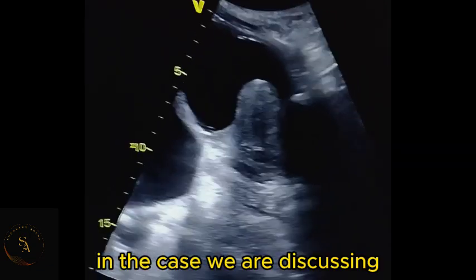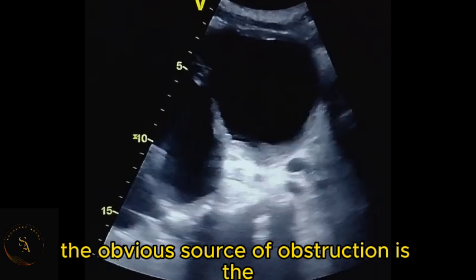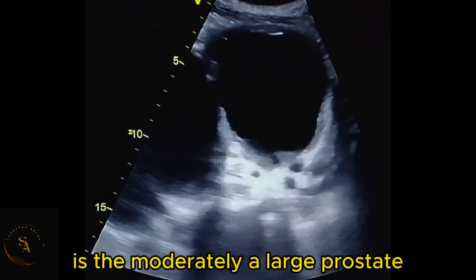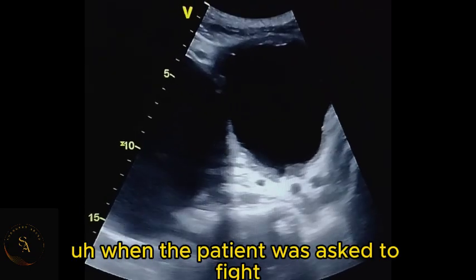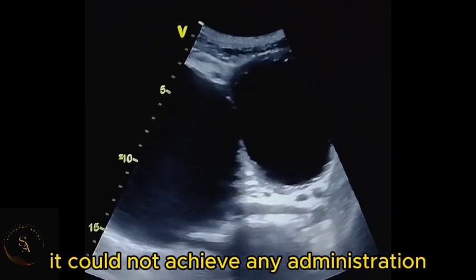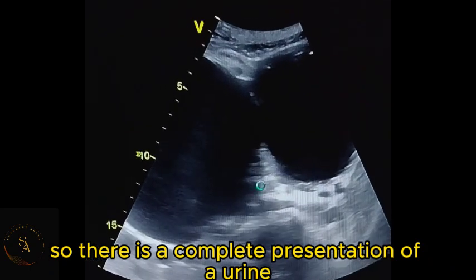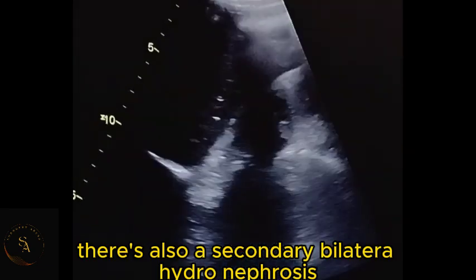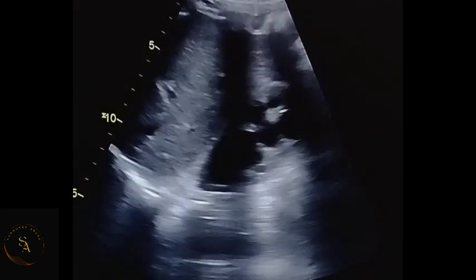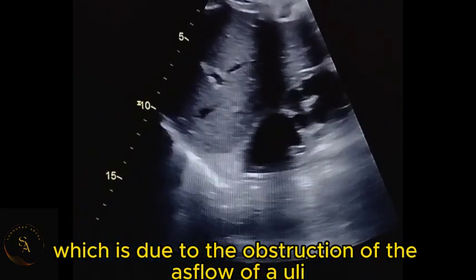In the case we are discussing, the obvious source of obstruction is the moderately enlarged prostate. When the patient was asked to void, he could not achieve any micturition. So there is a complete retention of urine. There is also a secondary bilateral hydronephrosis, which is due to the obstruction of the outflow of urine.